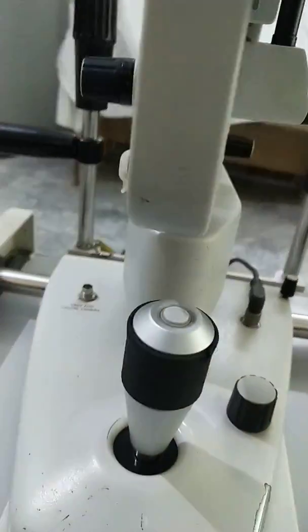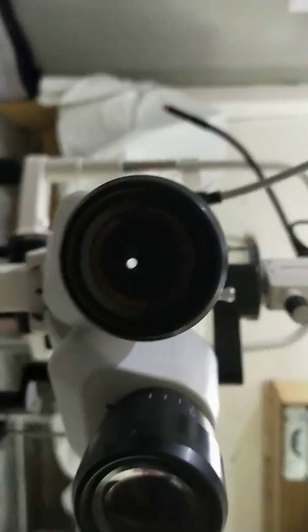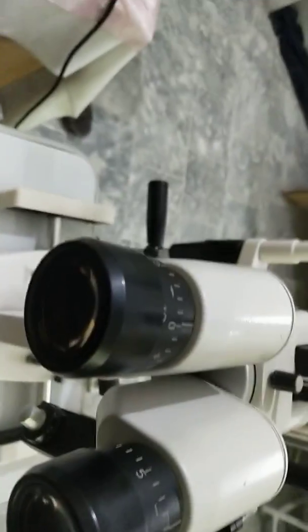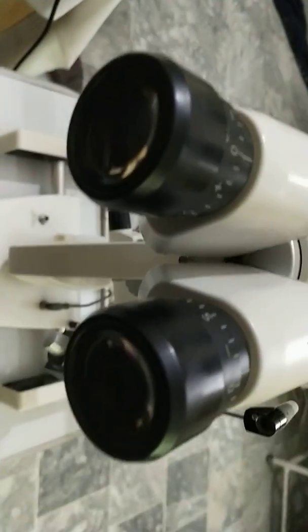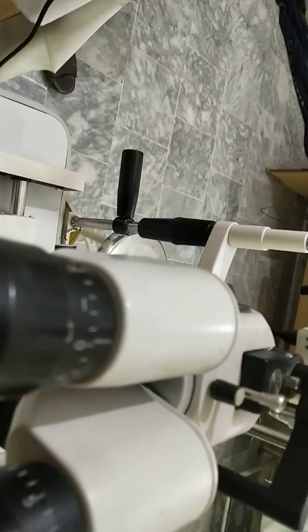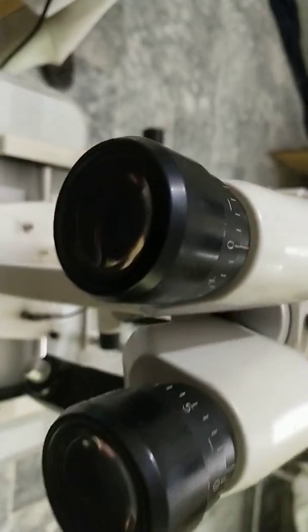Now here we have got the eyepieces. Before examination you should make it on the zero zero or according to your refractive error.